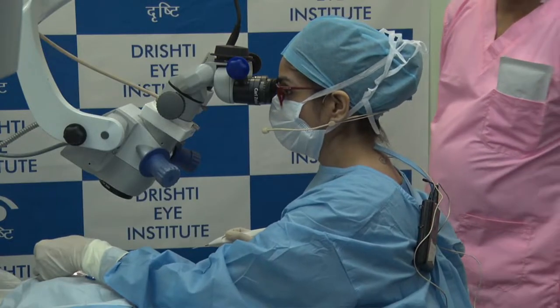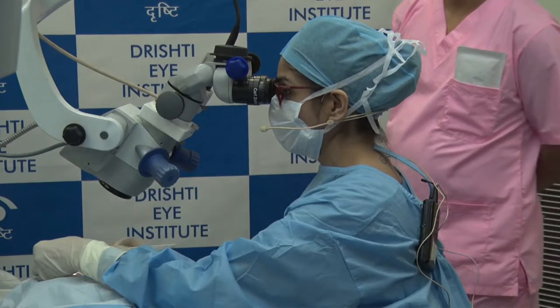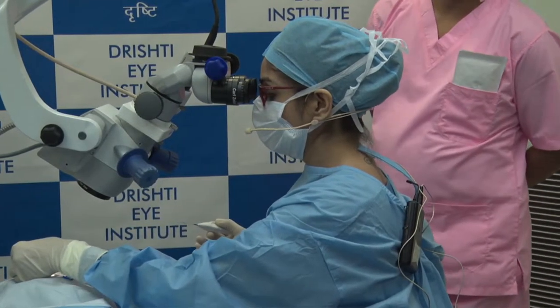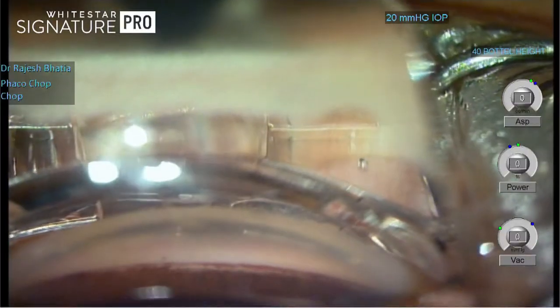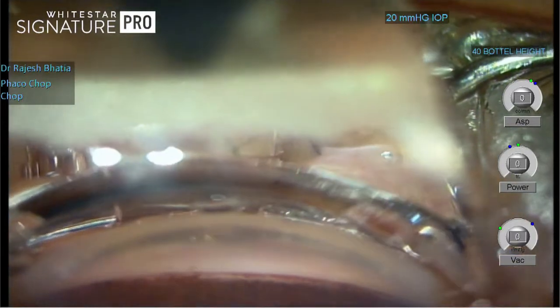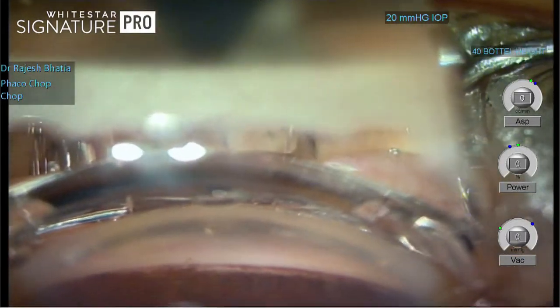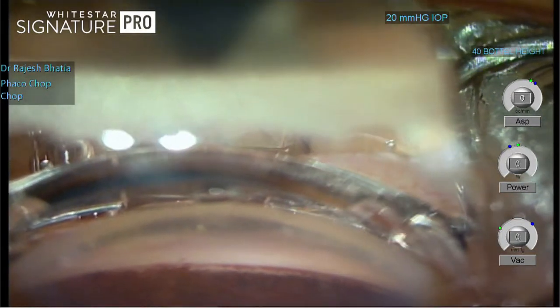Good afternoon, everyone. And thank you so much for having me, Dr. Luthra. This is a wonderful setup that he has. So what I'm demonstrating over here is micro-incision glaucoma surgery. And we are going to be using an iStent inject implant on this patient who's got an open angle over here. What I've done is already positioned the patient. I'll show you how at the end of the surgery.